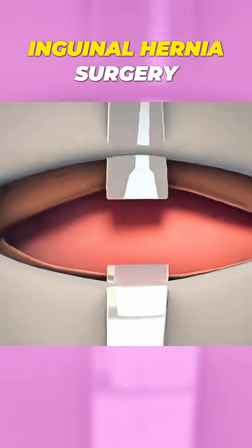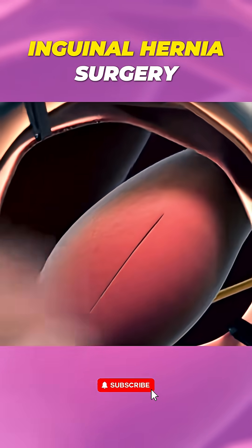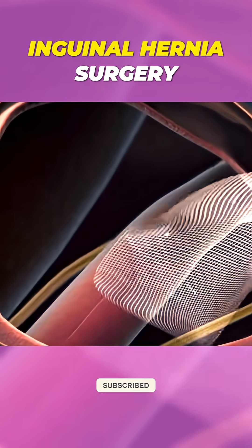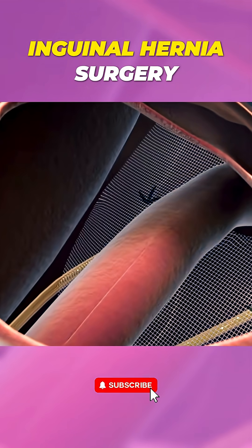In open surgery, a single incision is made near the hernia site in the groin area. The surgeon gently pushes the herniated tissue back into place. Next, a synthetic mesh is placed over the weak area of the abdominal wall to strengthen it and prevent the hernia from coming back.